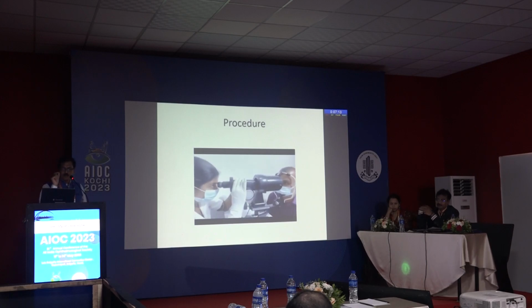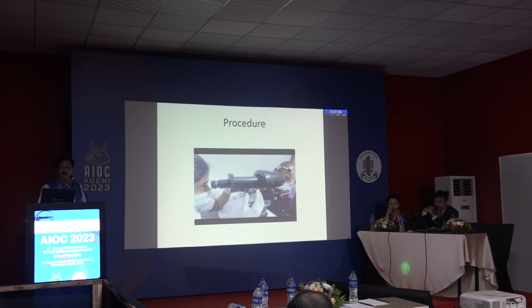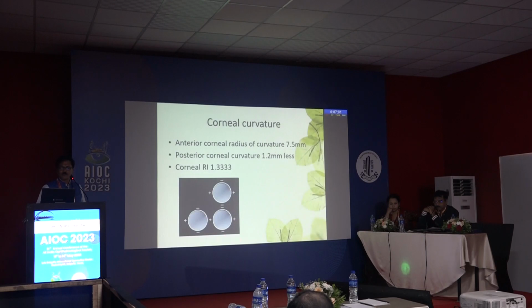After you focus the mires, you have to rotate this. There is a vertical knob, one is for the horizontal, and the concentric one is for the axis. After doing all this, you will get this sort of mires, what the examiner sees. Here, the plus should be in the center; horizontally it is well aligned, and you see only a single plus, but vertically it's still not aligned. Those two minuses should also come together.